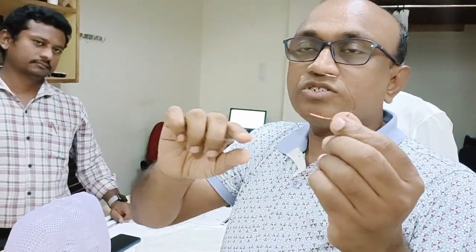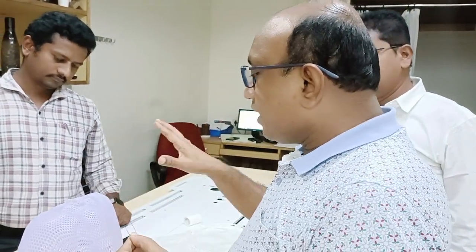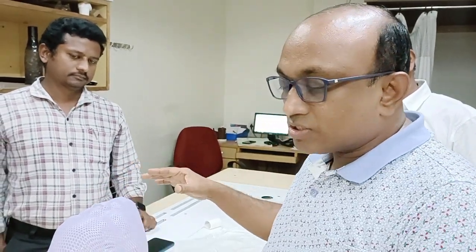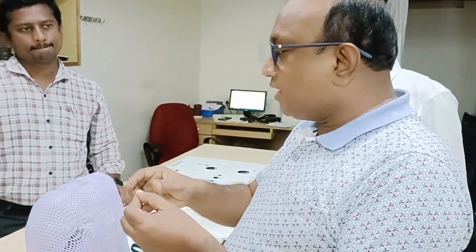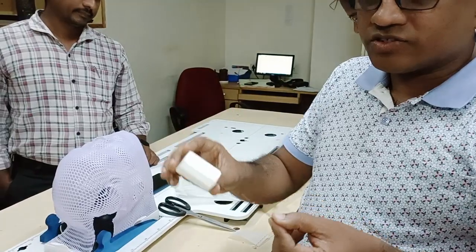The copper wire will be visible on your CT scan and you can delineate the GTV very nicely. For any skin tumor, in any area, first place the copper wire around the scar or tumor, then fix it to the skin with micropore tape.